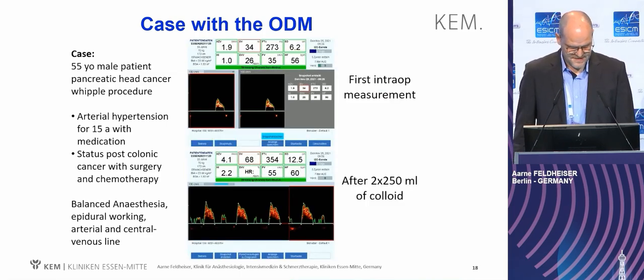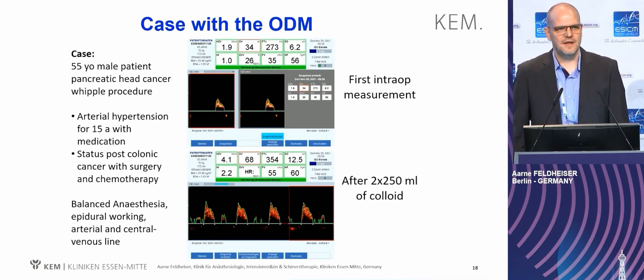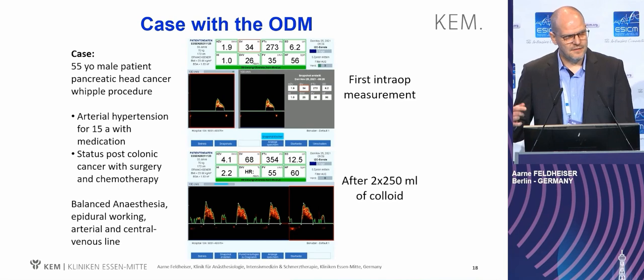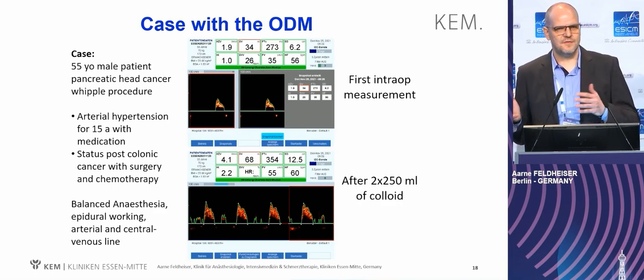So you do a testing, the first measurement 34, then you do a second one. We had in that case a substantial increase of stroke volume, so the patient had a benefit. I did a second trial, and at that point the patient turned negative, no more stroke volume increase. And then based on the physiology, we can come back to our normal values because stroke volume is individualized.